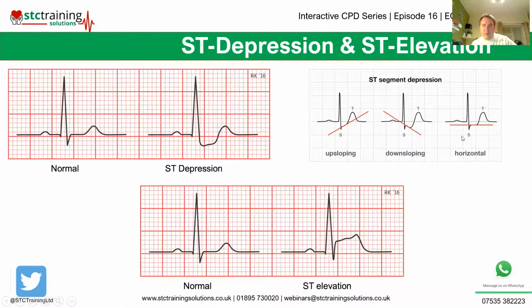There's some good CPD there if you want to have a little read into which is best and what it all means. But generally speaking, ST depression, if you see it, means the heart muscle isn't getting enough oxygen.